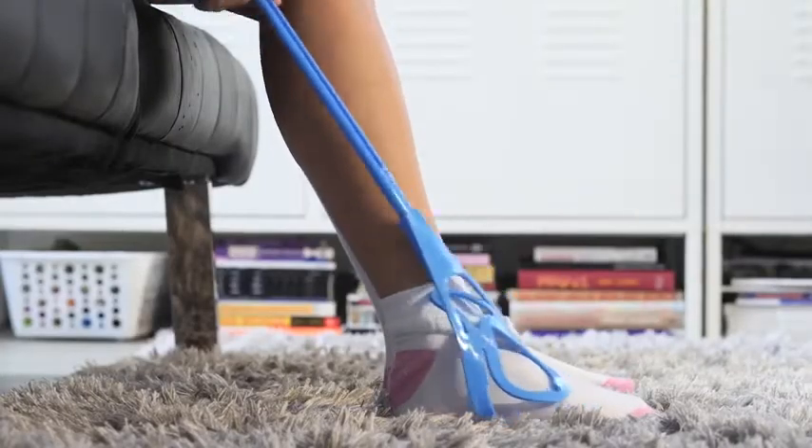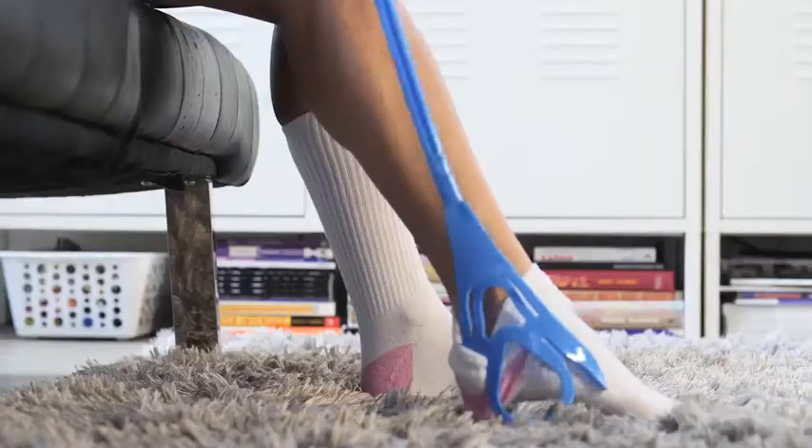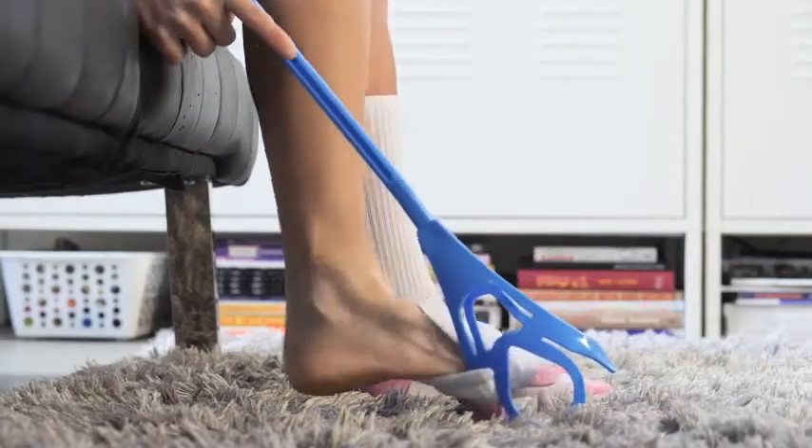To remove your sock from a comfortable seated position, hold the handle, insert one of the sock removal tabs, and push downward until your sock comes off.